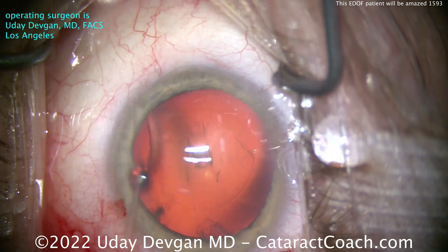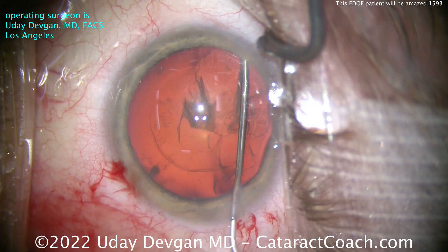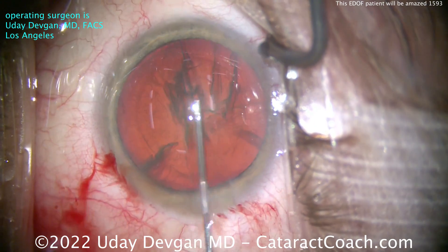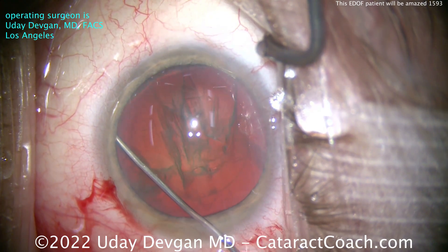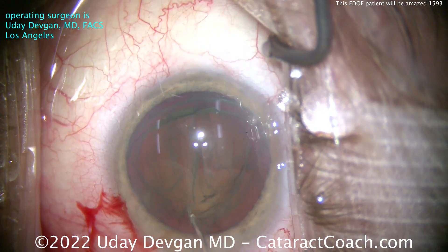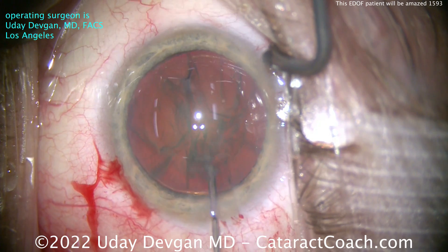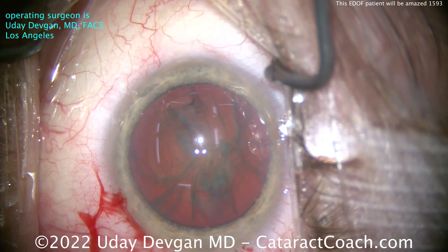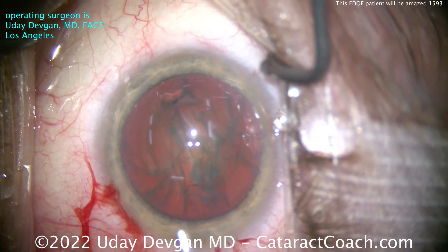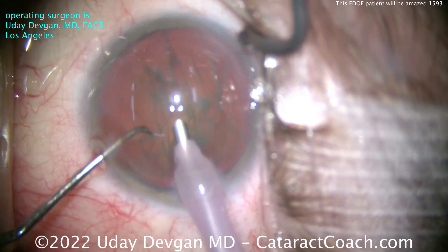The patient has very realistic expectations, already walking around a little myopic and under-corrected. What's the downside of an EDOF lens like this? This EDOF lens with the central focusing element puts about two-thirds of incoming light to distance vision and about one-third to the intermediate zone, which is roughly 60 centimeters. Because of that, the downside at night is about one-third contrast loss — two-thirds of photons go to distance, one-third still go to intermediate, and you can't change that even when driving at night.